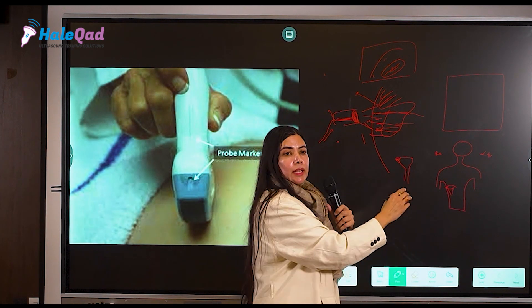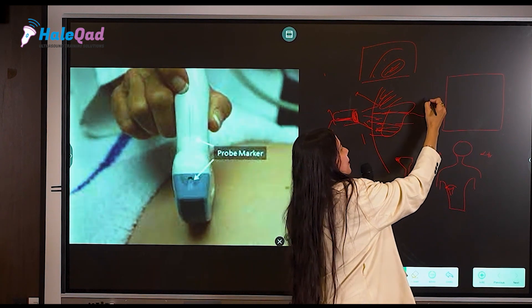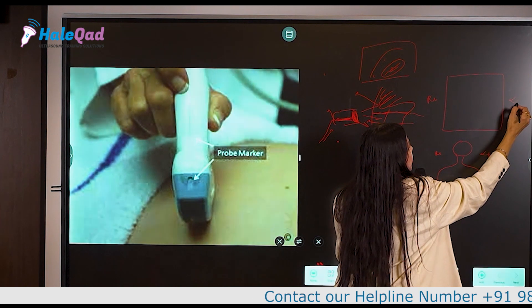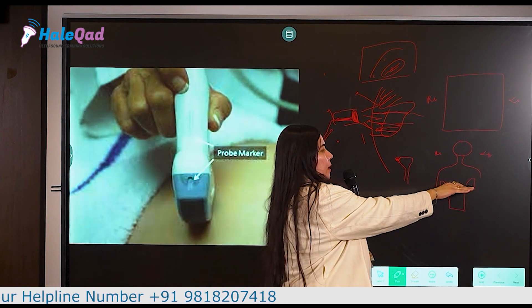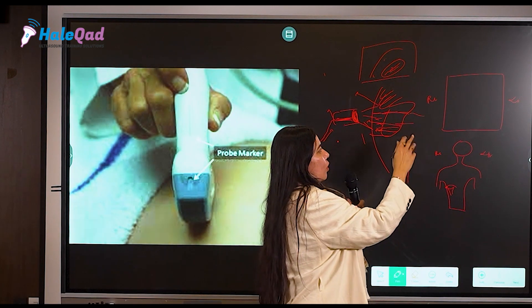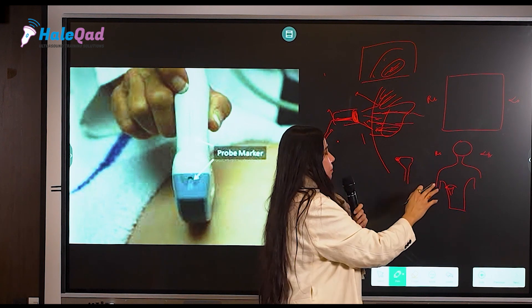This is the right side of the patient anatomically, and this is the left side. So the probe marker should be held like this — if you are holding your marker towards the right, then on your screen the right side will be reflected as right and this side will be reflected as left, when you are holding your probe in a transverse position.